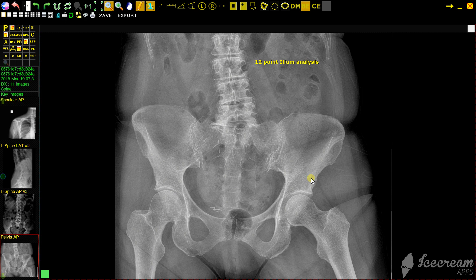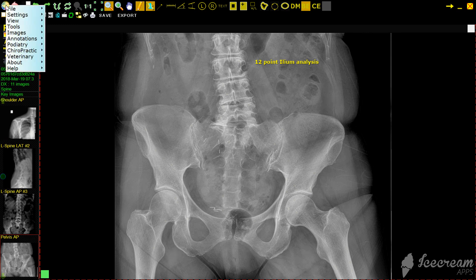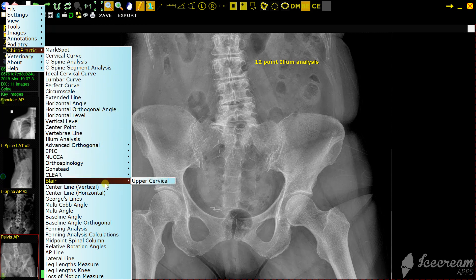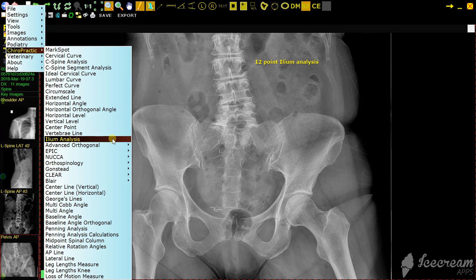Hi, this is Chuck Long with 2020 Imaging. I'm going to show you the 12-point ilium analysis. Please keep in mind that I am not a chiropractor. First, we're going to go up and get the drop-down menu and go to chiropractic, then click on ilium analysis.